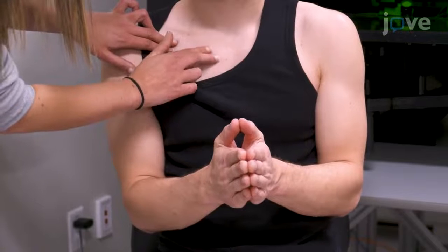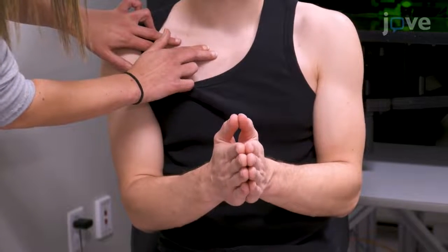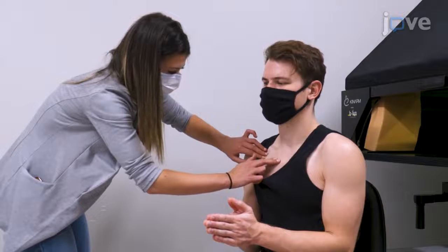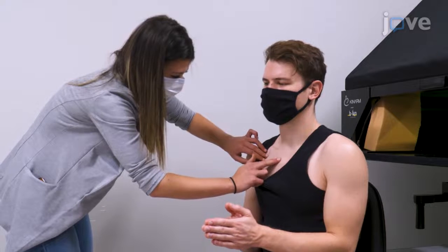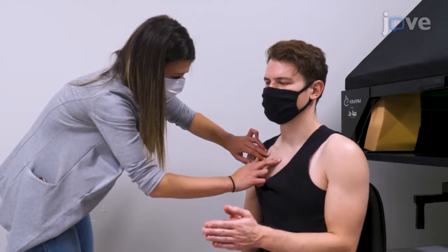For the clavicular head of the pectoralis major muscle, ask the participant to relax their elbows at their sides and push their palms together. If it is difficult to visualize the target muscle, palpate the area of interest while having the participant repeatedly perform the requested action. Target areas with notable changes in the muscle for electrode placement.